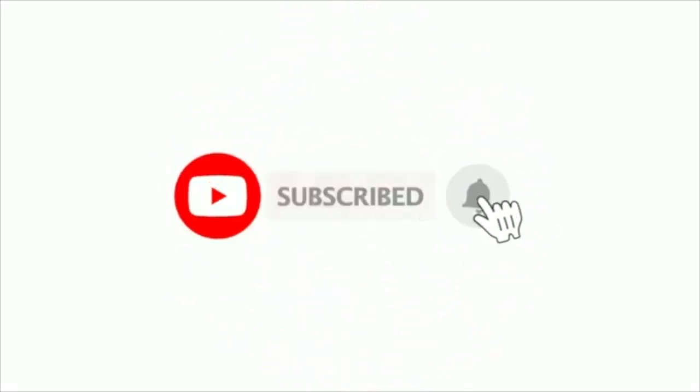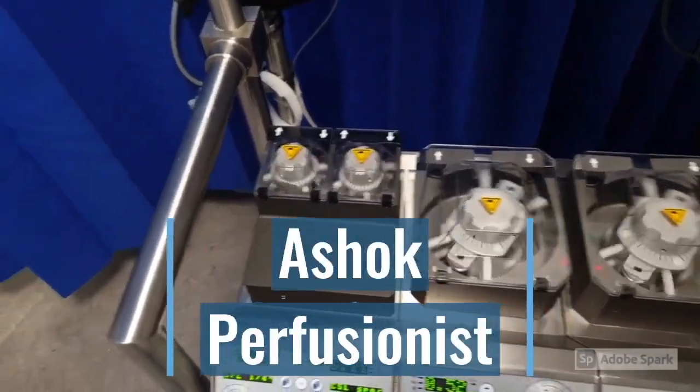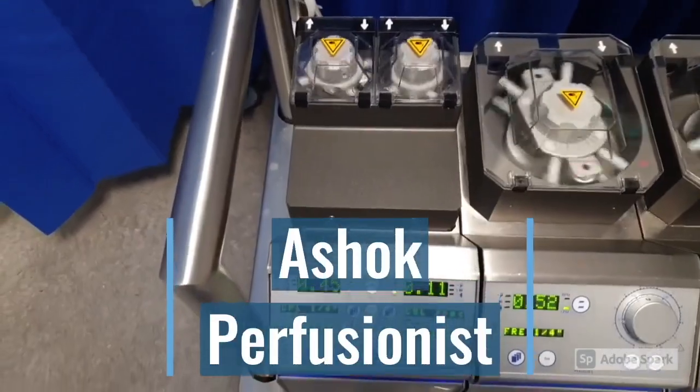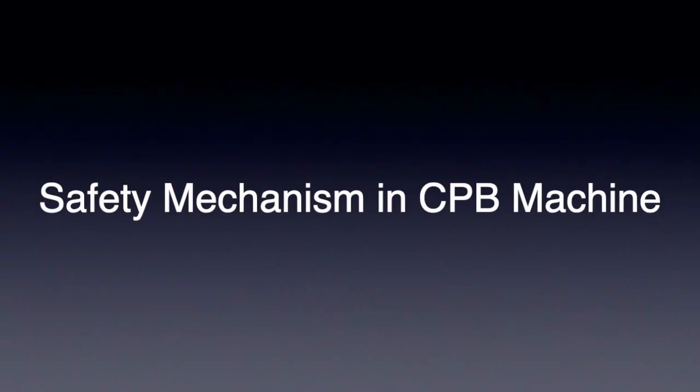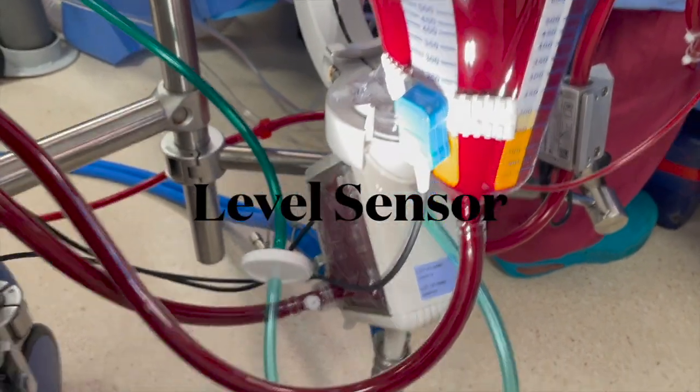Today we are going to look at the safety mechanisms in cardiopulmonary bypass. The main ones are the level sensor and bubble detector. The possibility of gas embolism entering to the patient undergoing cardiopulmonary bypass is a serious threat to the patient and of course a constant concern to the perfusionist.